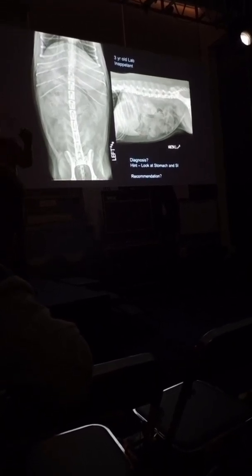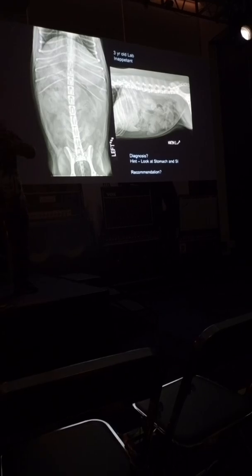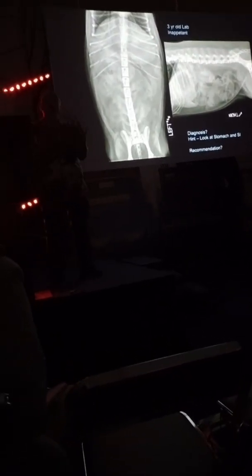Meaning it's a true obstruction, either from a foreign body or material, or the wall of the stomach is thickened, not allowing things to get out.